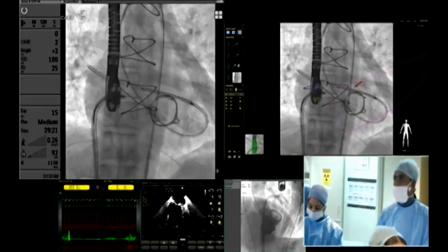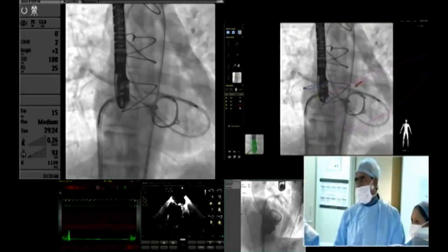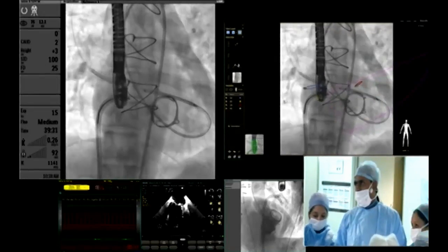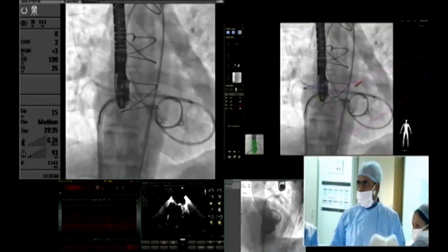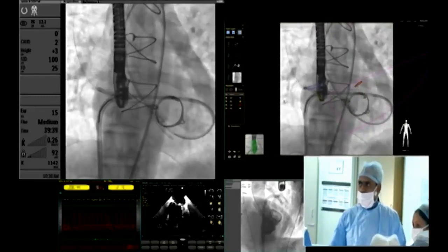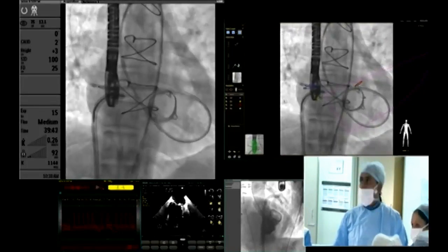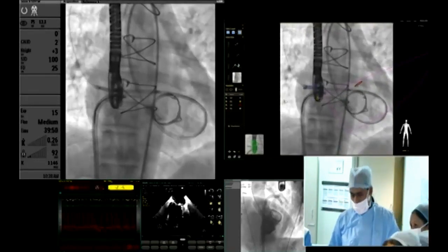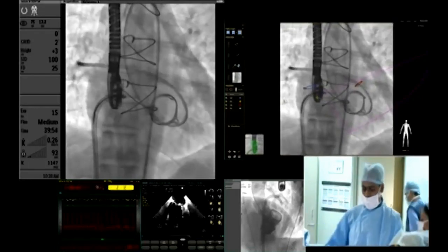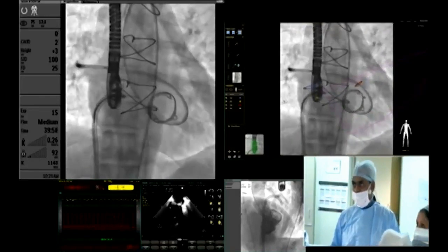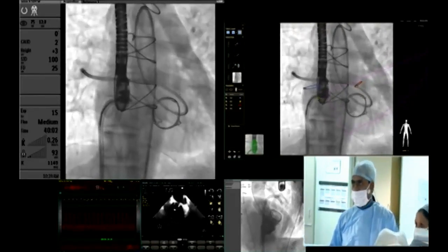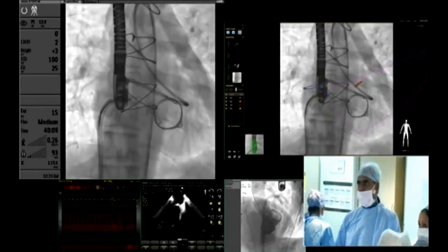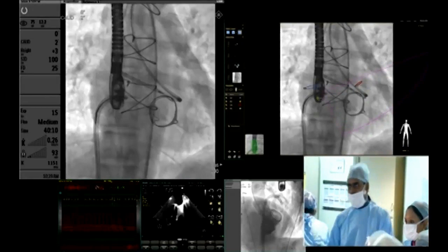Once your plug is already deep into the sheath and you are almost in the LA, at that point in time I don't think there is too much concern about retention. Now I have deployed the left atrial disc already. We can see that — this is AVP2 which has 6 layers and three discs.